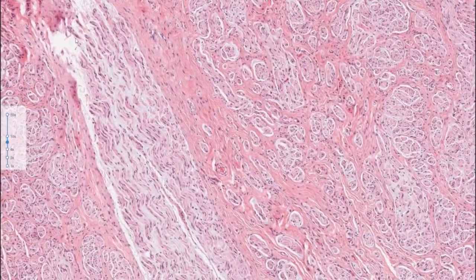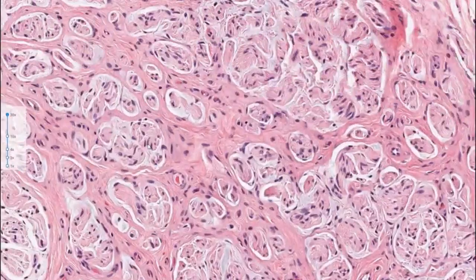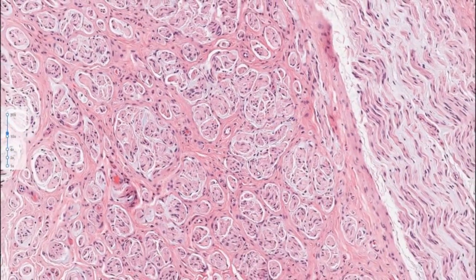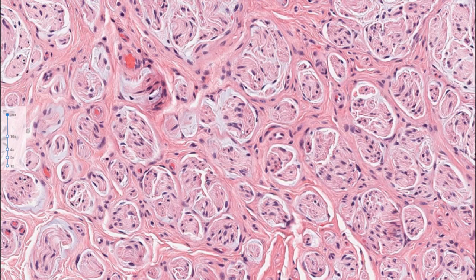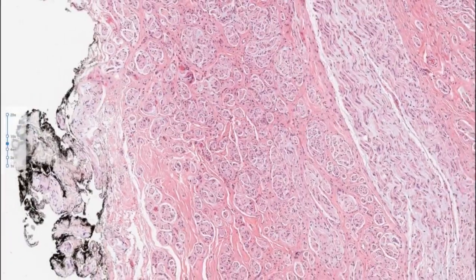Here you have a more intact peripheral nerve fascicle. So you see these are really tiny, disorganized, and associated with connective tissue. This is what is known as microfasciculation. So you have very tiny little fascicles growing in a disorganized fashion. If you do certain stains, you will have all the components of the peripheral nerve sheath here. You will have Schwann cells proliferating alongside perineurium, and each one of these little fascicles will probably have one or more axons coursing through it.